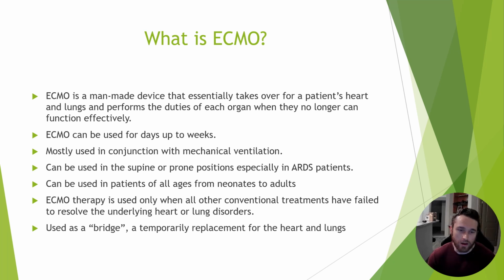So what is ECMO? ECMO is a man-made device that essentially takes over for a patient's heart and lungs and performs the duties of each organ when they no longer can function effectively. ECMO can be used for days up to weeks, mostly in conjunction with mechanical ventilation, but it can be done without mechanical ventilation, though that is very rare. It can be used in the supine or prone positions, especially with patients with ARDS, and in patients of all ages, from neonates to adults. ECMO therapy is used only when other conventional treatments have failed to resolve the underlying heart or lung disorders, and it is used as a bridge therapy. It's not a treatment, it's more of a temporary replacement for the heart and lungs while they have time to heal.